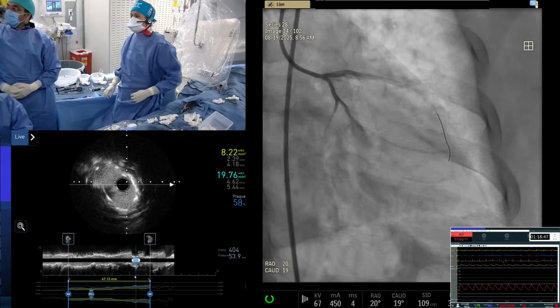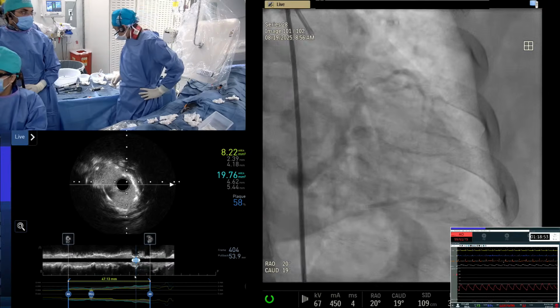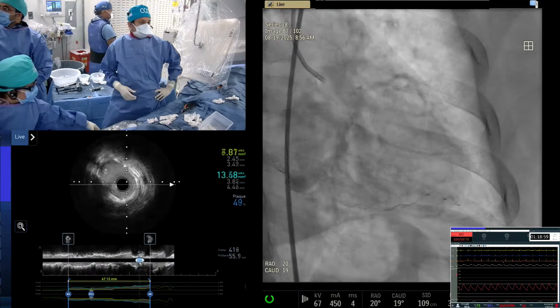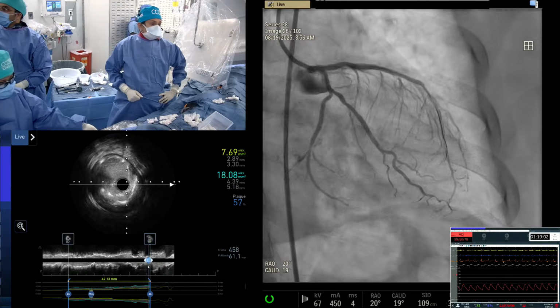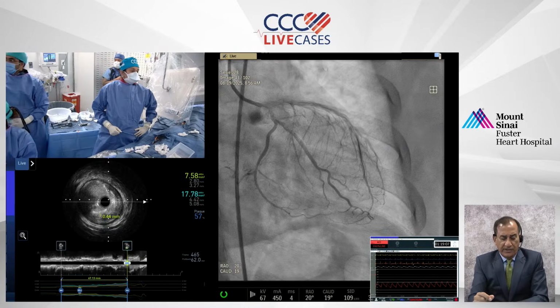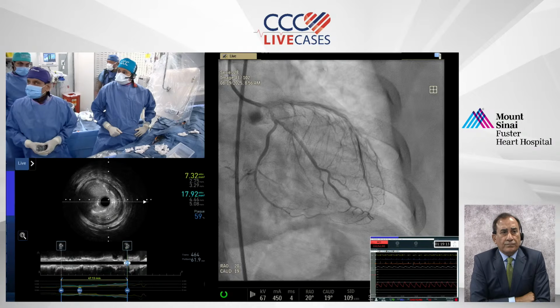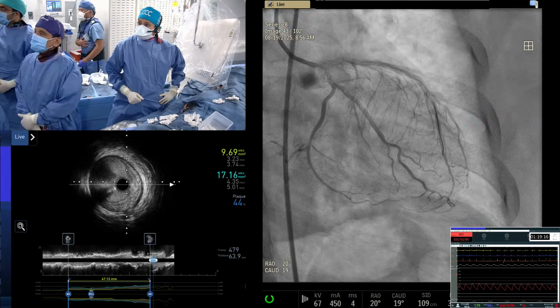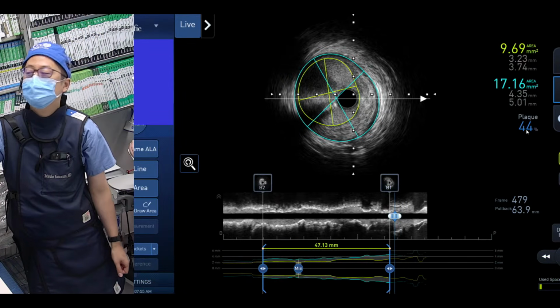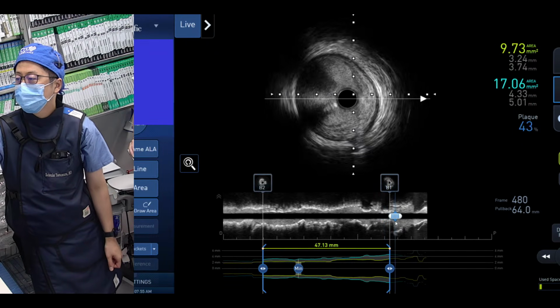But do we need to post-dilate or not? There is a malapposition but it does not fit the criteria. It is on the plaque, so if we go for aggressive post-dilation, there's a perforation risk. I think we leave it alone. A question for Kiski also here: was there significant plaque burden at the proximal stent edge? It's not significant. It's on the plaque, and this is AI calculated, the plaque burden is like 44%. It's on the plaque, but it's less than 50%, so it's an optimal result and very good lumen. Yes, yes. Then I think we are good.